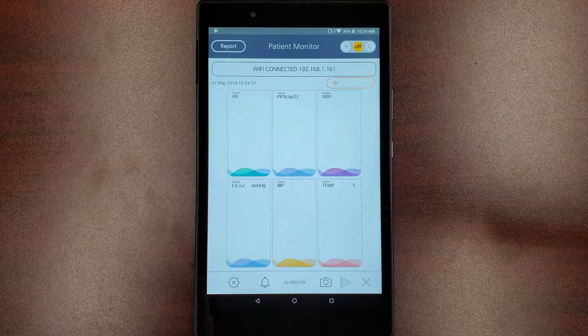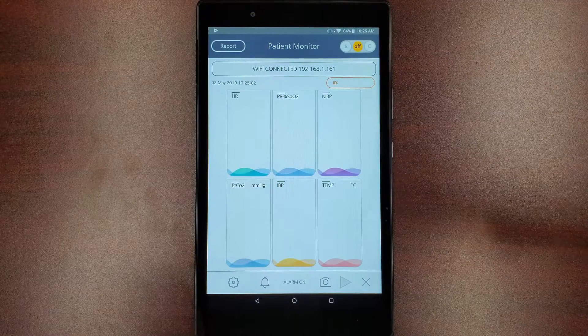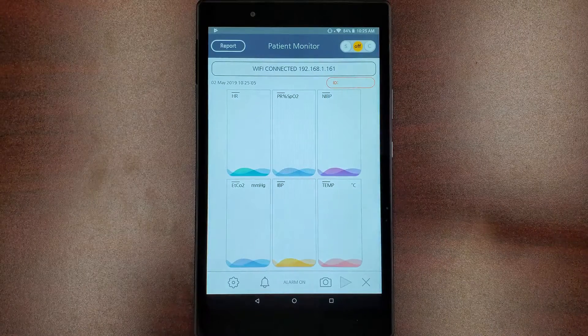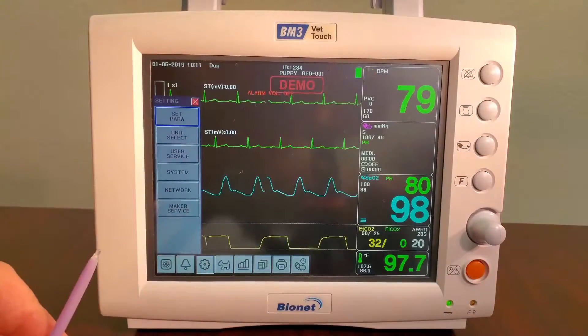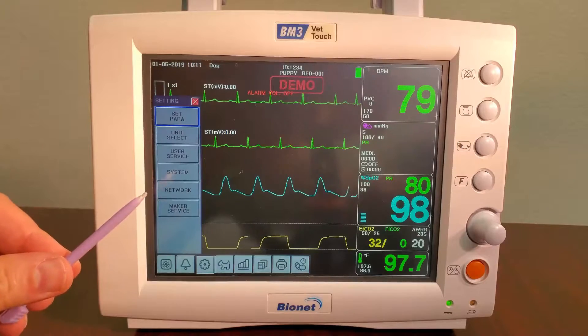To connect this mode, first write down the IP address located at the top of the screen on your BT Link mobile app. Next, press the gear icon on your patient monitor and then select Network.